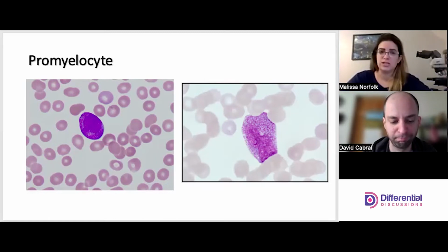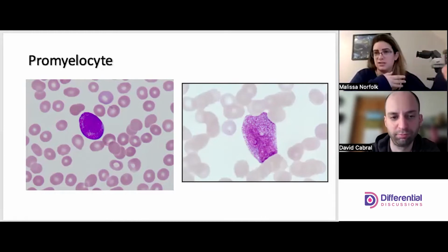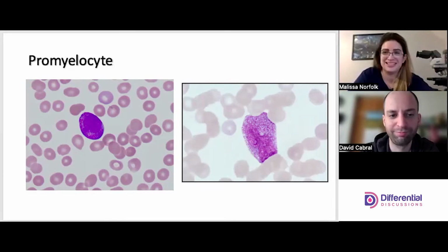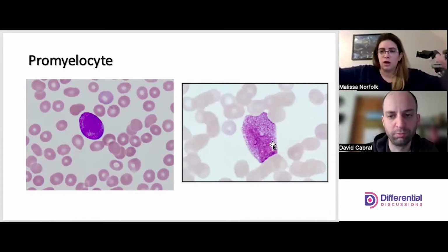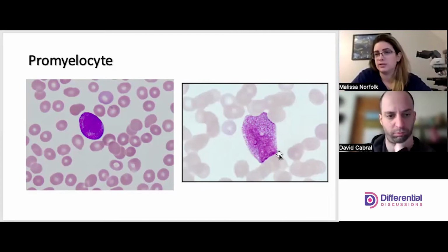Eccentrically just means not centered, off to the side. So here you have this one pushed off over here, very round, and this one is a little larger and spreadier, but it's still pushed off to the side.